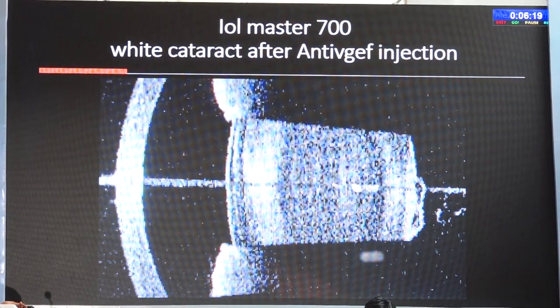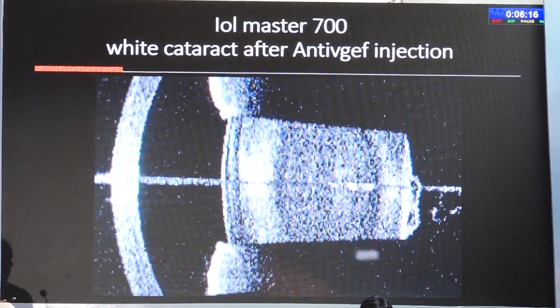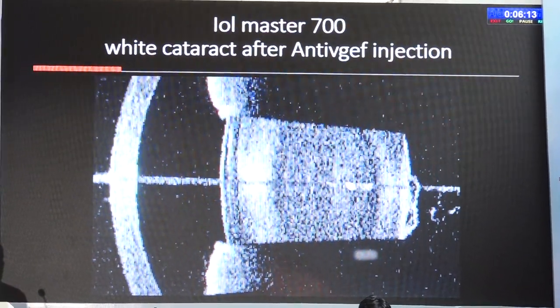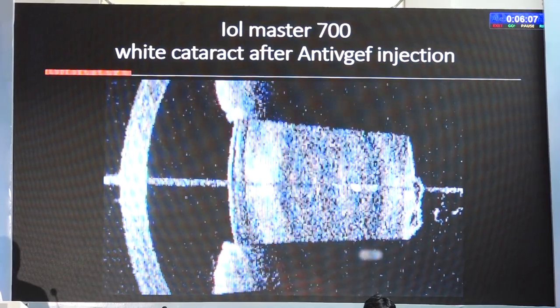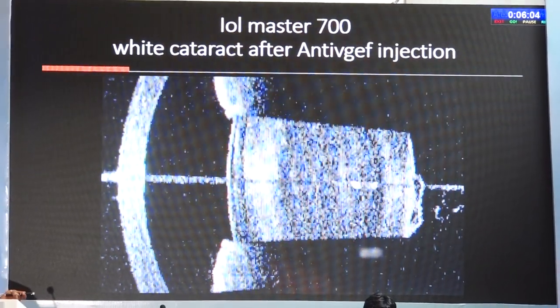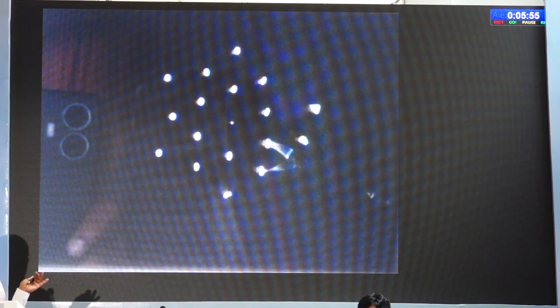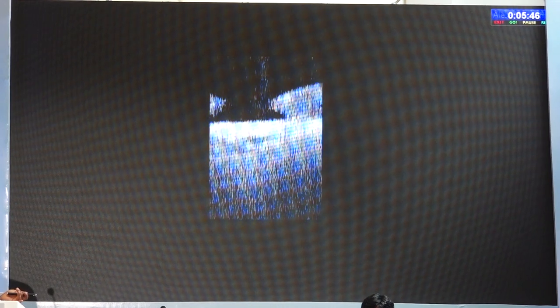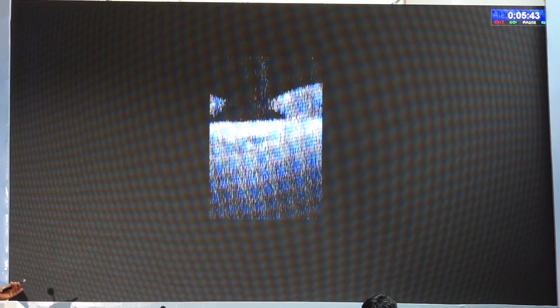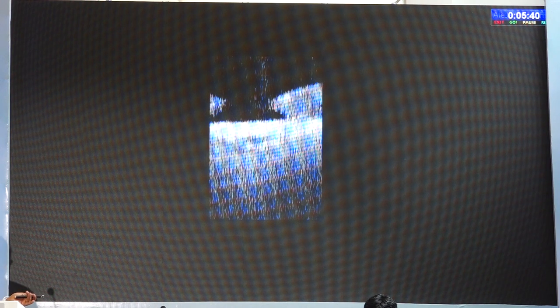Here is a patient who had intravitreal injections who came for surgery. On the slit lamp he just had a white cataract, but the optometrist picked up a small tear of the posterior capsule because it shows up easily in the IOLMaster 700. So before taking up surgery in a white cataract, we know there is a tear of the posterior capsule. Similarly, a dense cataract with poor vision — we will easily miss a macular hole unless we do an OCT, but it will be picked up by new generation SS-based optical biometers.